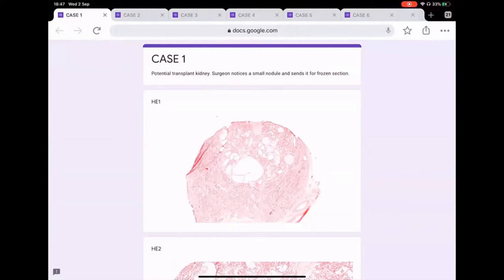Yes, absolutely. If you think that you have enough atypia, mitosis, necrosis, and things, and you want to call it malignant spindle cell neoplasm, that's absolutely fine. But this is as far as you can go, and there is no point in arguing it. I told you before, in the second session when we were discussing one of the soft tissue examples, you will be mad to diagnose a rhabdomyosarcoma, for example, or a leiomyosarcoma without immuno, even if it looks like so. So these are things that you need to be aware of in these scenarios. Don't get dragged into this discussion. Only answer the questions if they are histologically relevant.